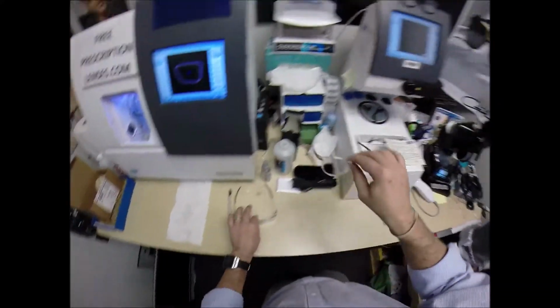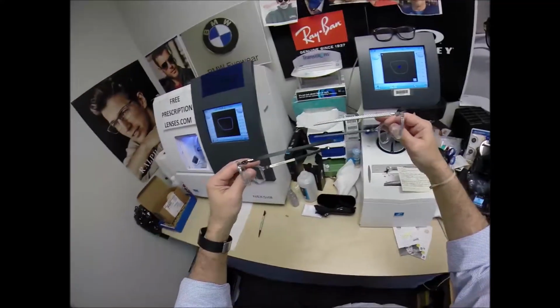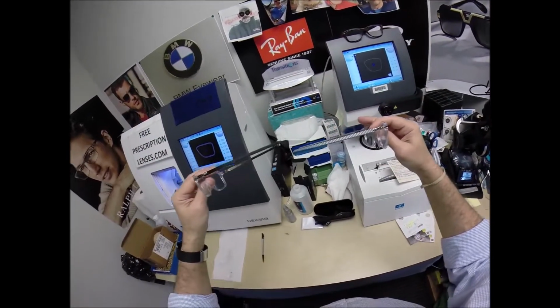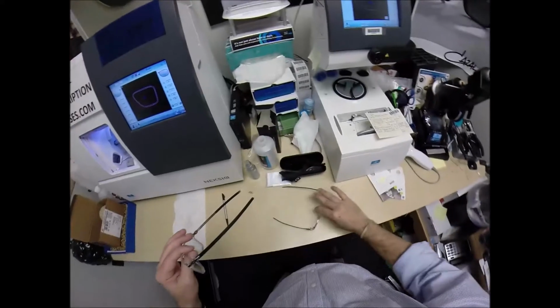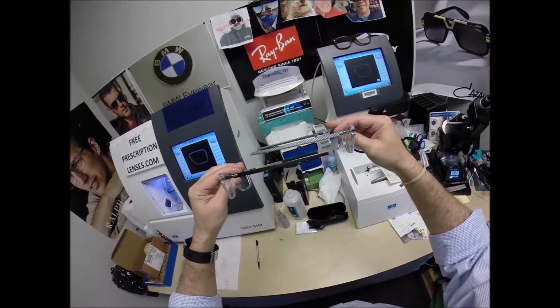Now, this is what's known as the pilot temple. It's straight. If you can imagine a World War II fighter pilot, this is where the term originated. If they're wearing a hard helmet in the cockpit, they can slide these on and off, whereas the Ray-Ban aviators that have a temple like this that curves behind the ears, they would have to take the helmet off to do that. So that's why Ray-Ban came up, and all older glasses back then used to have a pilot temple.